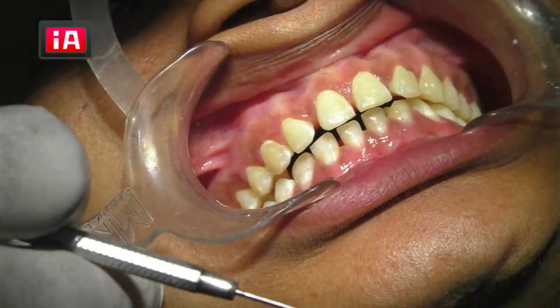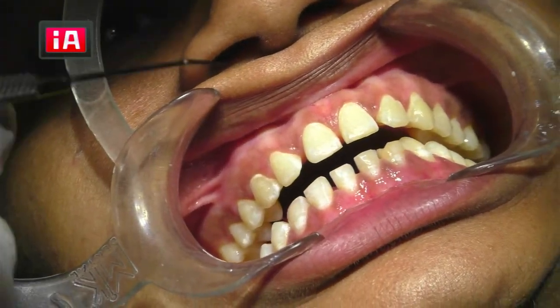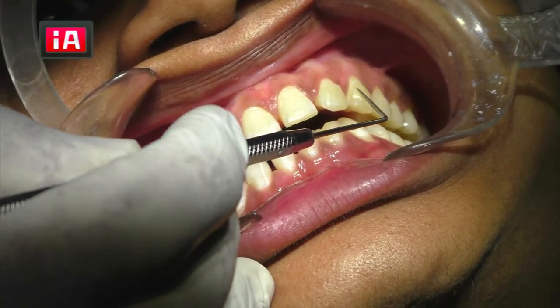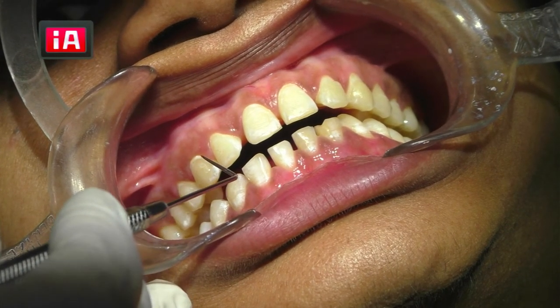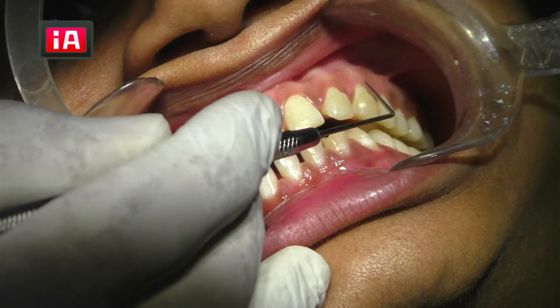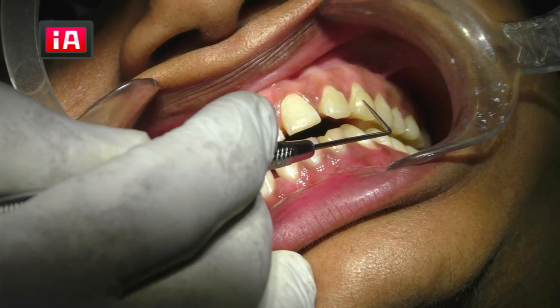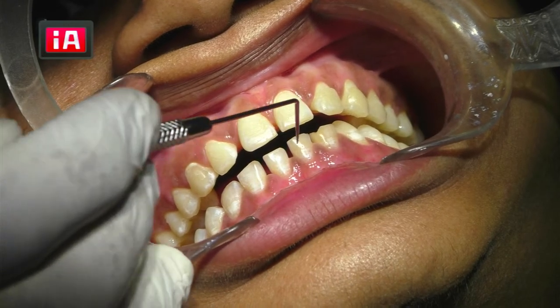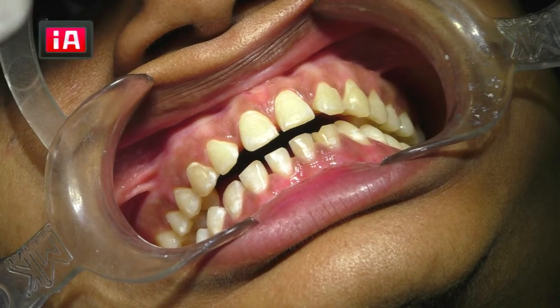So now we are going to start with the veneer preparation. We are going to do it in three parts. The first part will be the veneer preparation for canine to canine for indirect veneers. We are going to do it with e.max, or lithium disilicate, so I'm going to do the tooth preparation from canine to canine. In the second part, we are going to do a direct veneer for the lower. And the third part, veneer cementation.